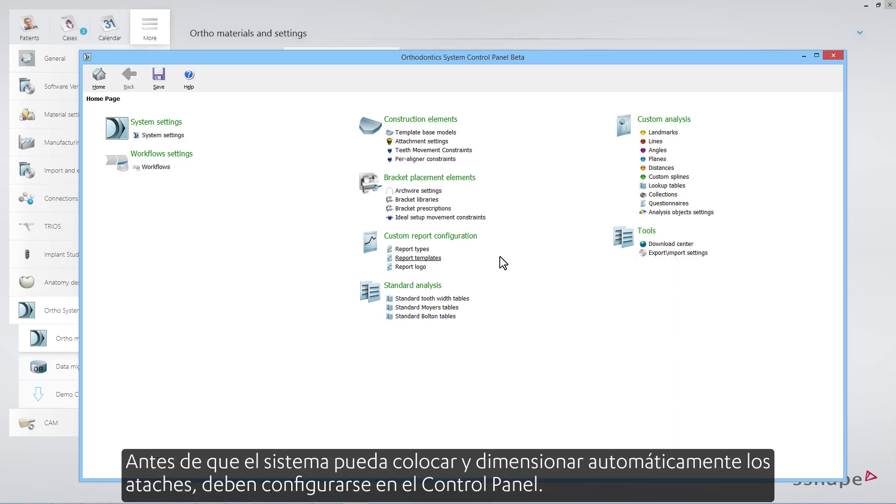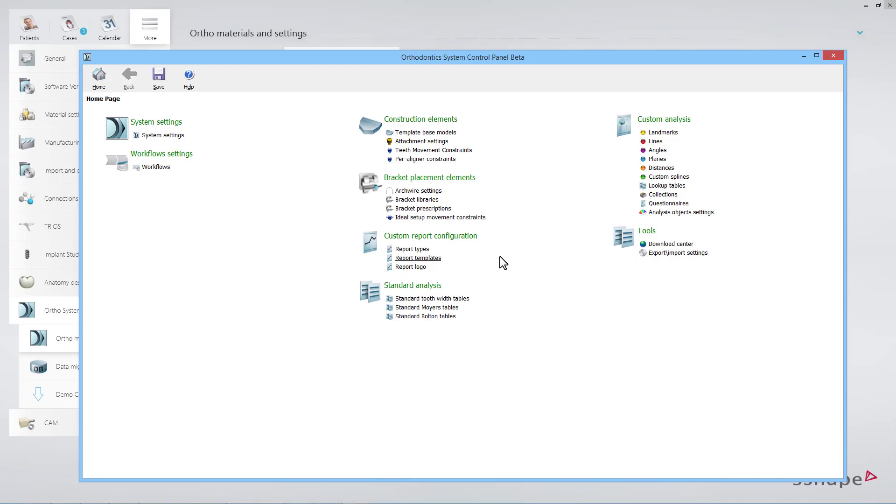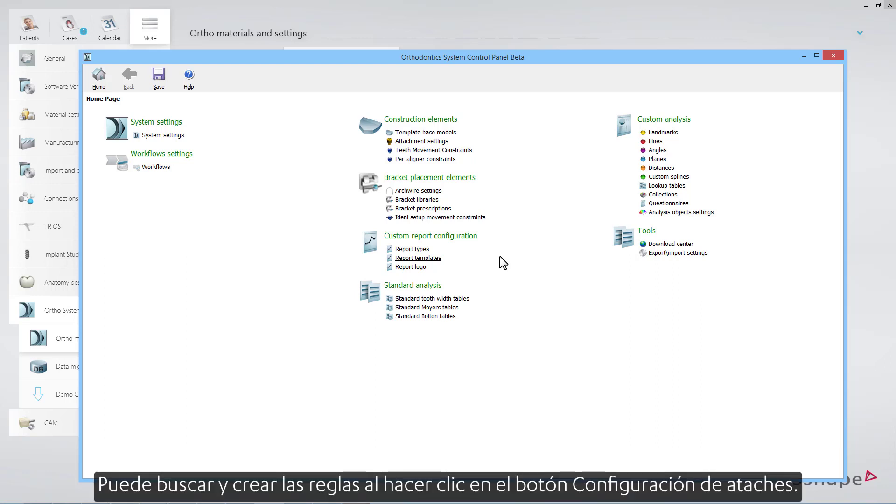Before the system can automatically place and size attachments, they have to be set up in the control panel. You are able to find and create the rules when you click the Attachment Settings button.